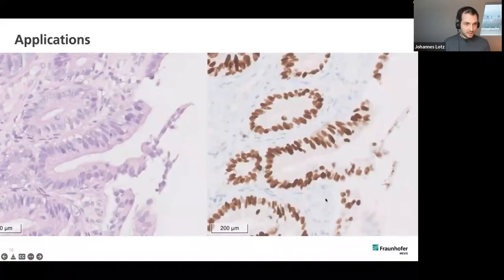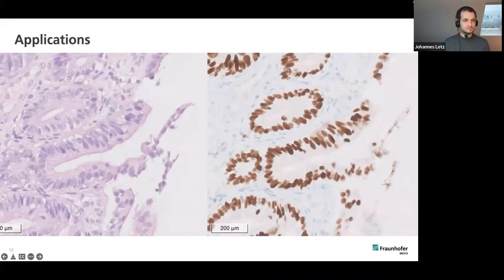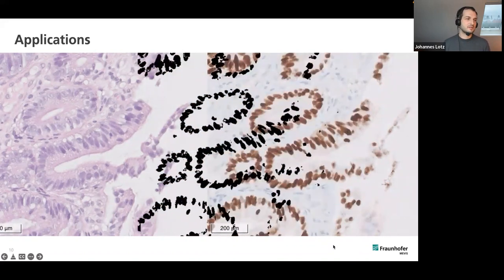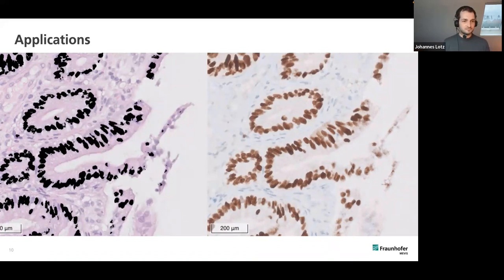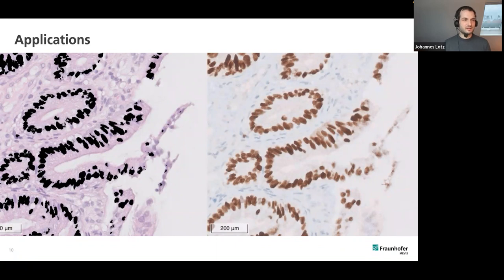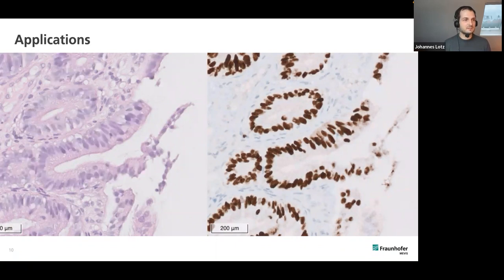The application is essentially the same in most cases: we have some annotations or automatically detected image features — such as segmented nuclei from a specific immunohistochemistry stain — and we want to transfer these annotations to another stain such as H&E. Registration allows exactly this: to transfer information from one slide to another, enabling different applications once the alignment is made.